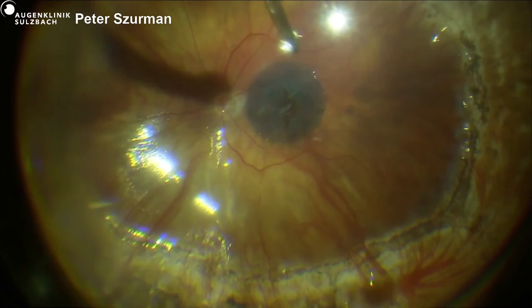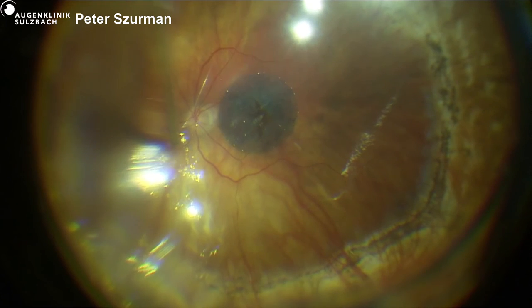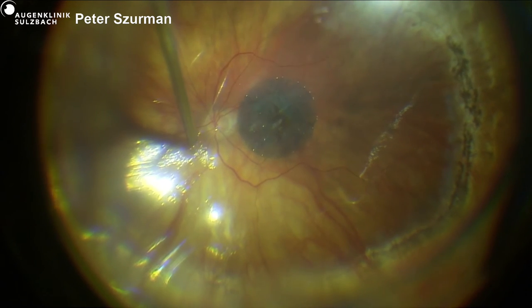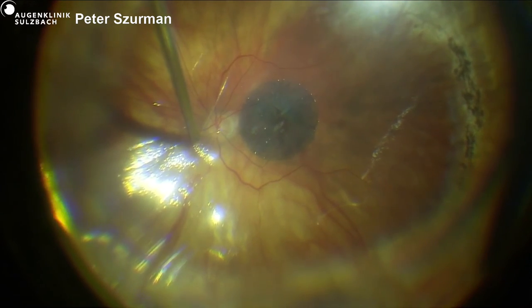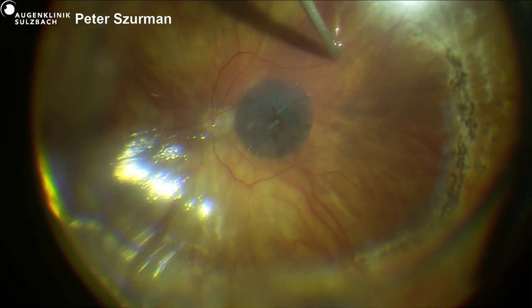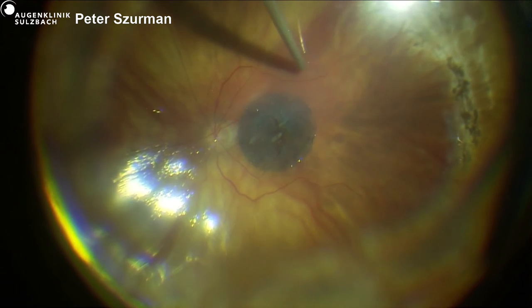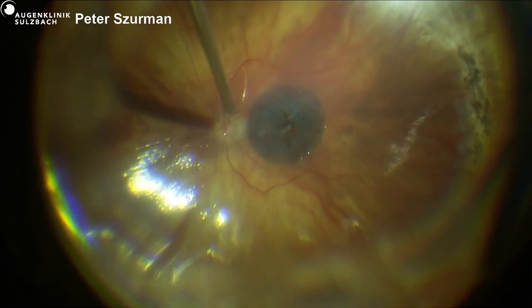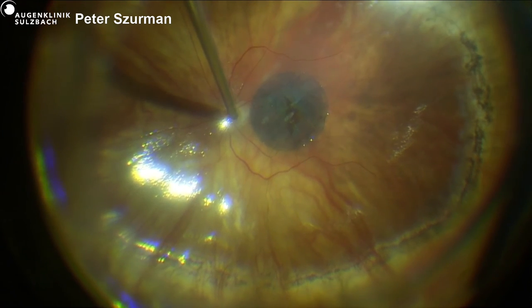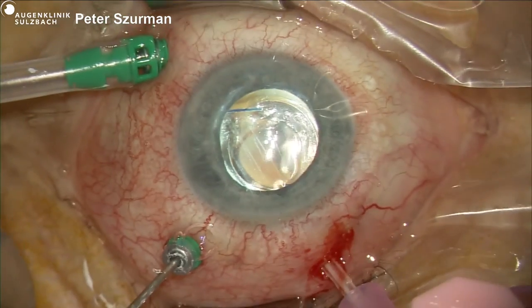And I did two marks because now I'm... Personally, in such a PVR case, I would do laser all around 360. And concerning the connection of the retinotomy, I think in this case it's not so important because it is very anterior. It's very close to the ora serrata. So the traction that can be caused by these bridges is very limited. I would be much more concerned if it was in the mid periphery. In room one, Cesare.